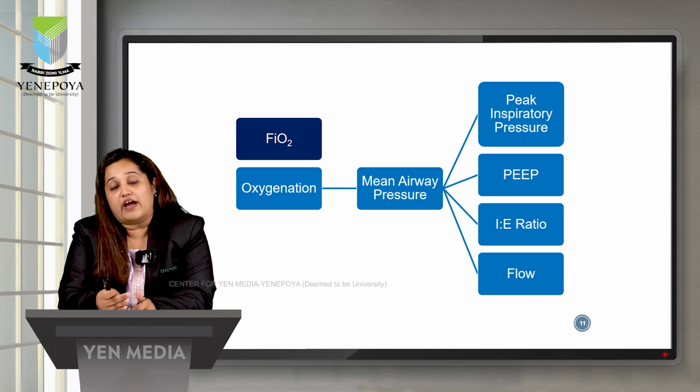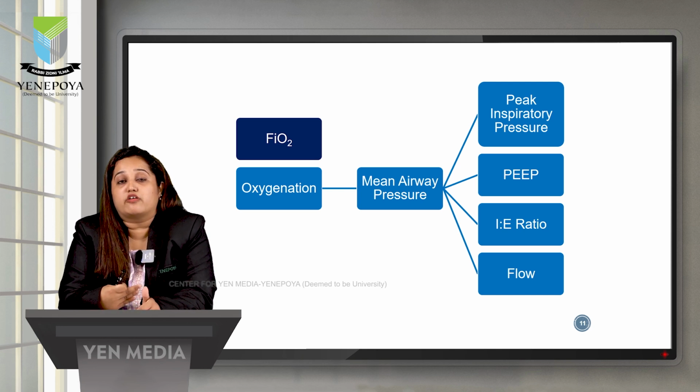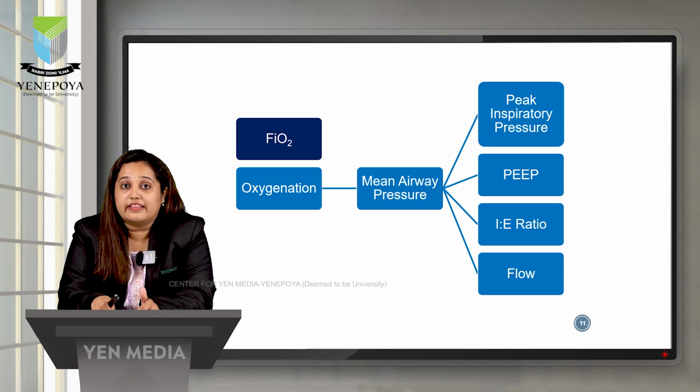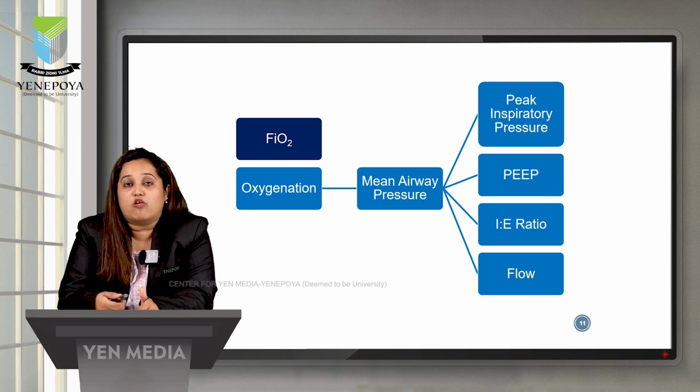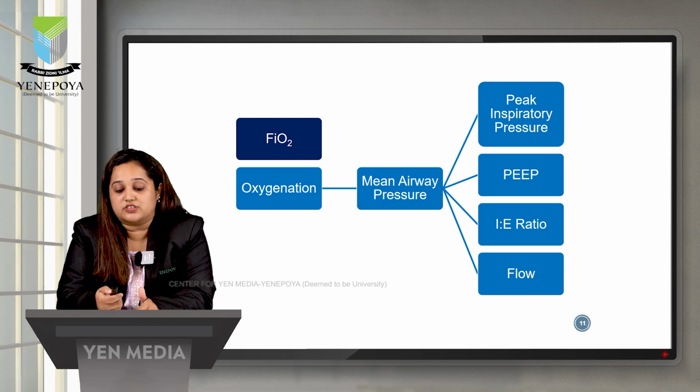Because if you go to 12 centimeters of water or 14 centimeters of water, it will indicate that the baby's requirement for oxygen is higher, and that will need you to use advanced methods of oxygenation like ECMO or high frequency oscillatory ventilation.